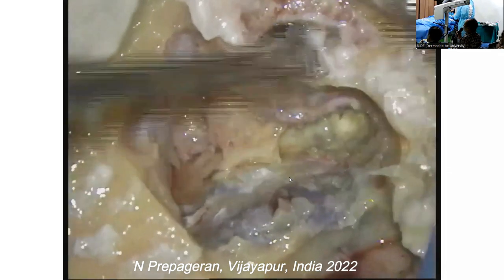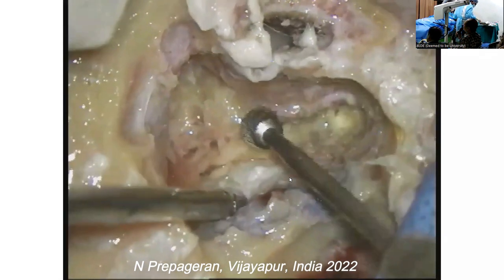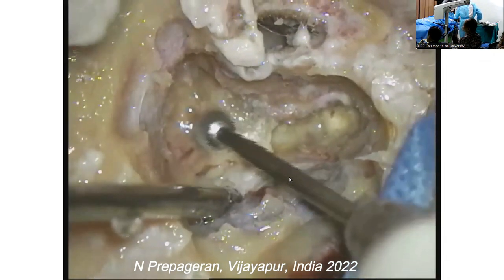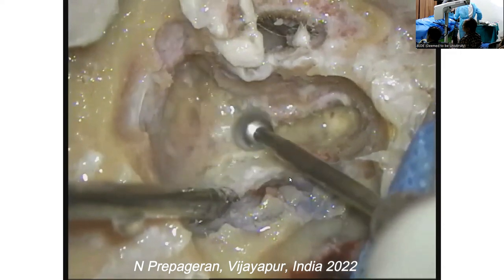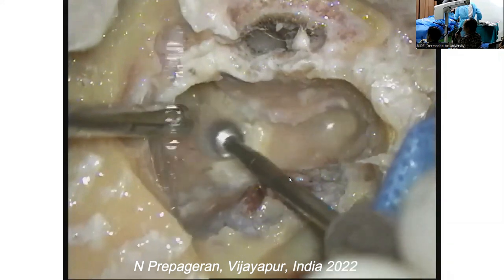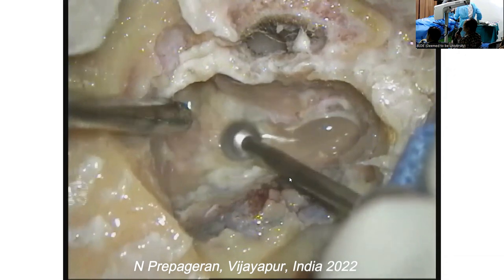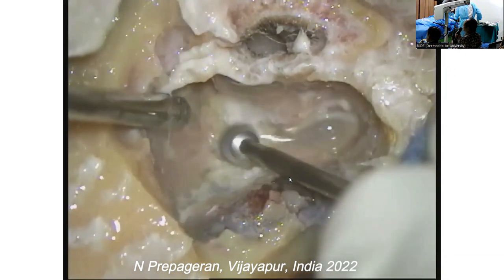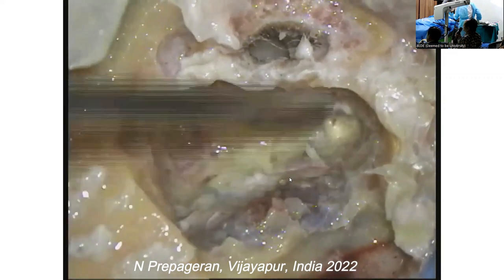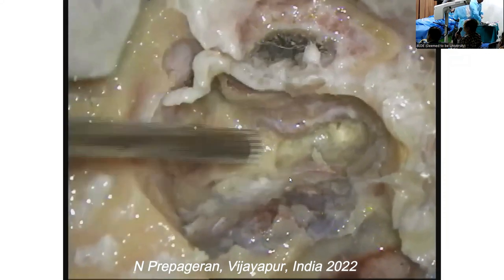It's too big. Am I giving back the old one? Let me just open up this one there, please. So now let's look for the posterior semicircular canal. So that's the problem: it kicks back and then the entire dissection is gone. Let's just use the diamond for the time being.